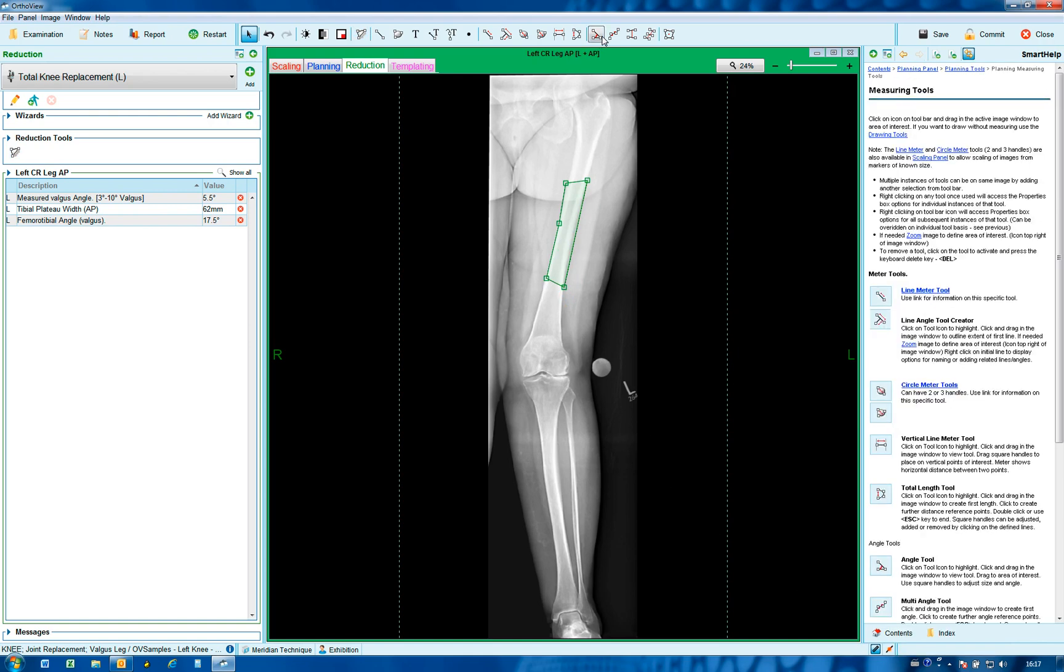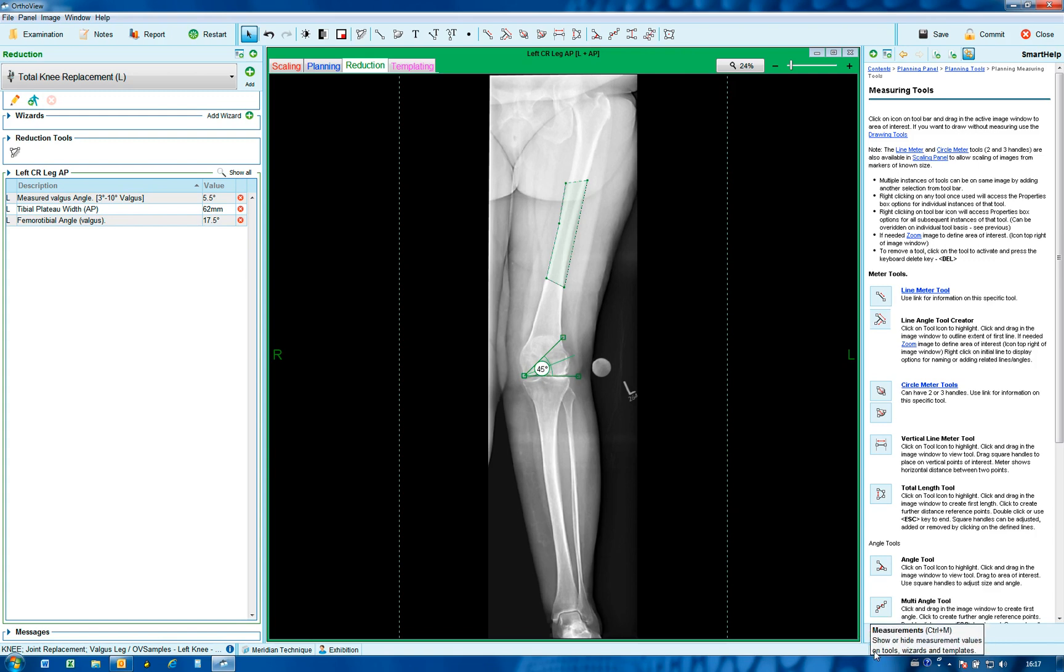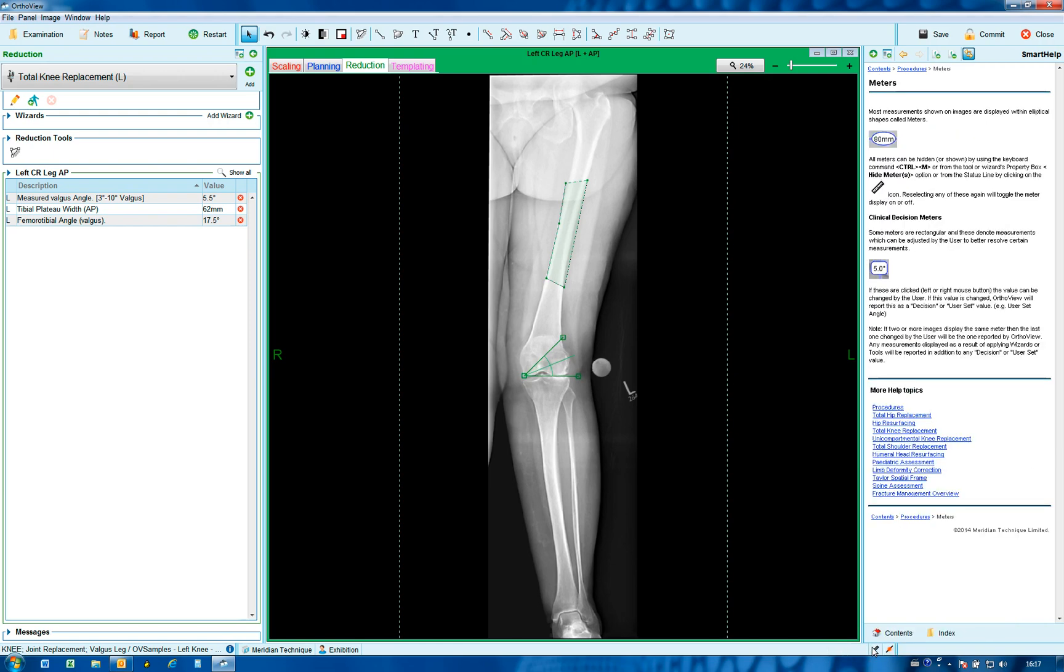Another feature which can be useful if a meter appears over an area of interest is Control M, but now also available as a toggle button. You'll see the meter disappears or reappears if that is selected.